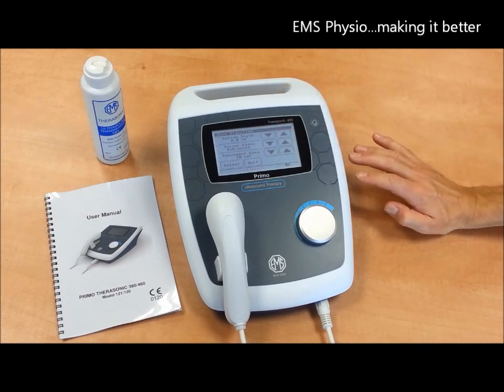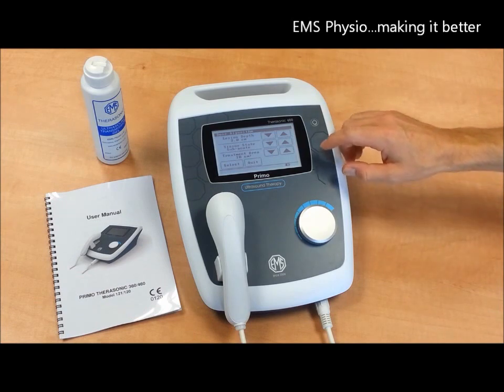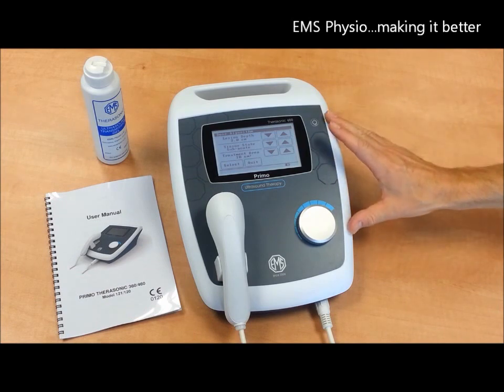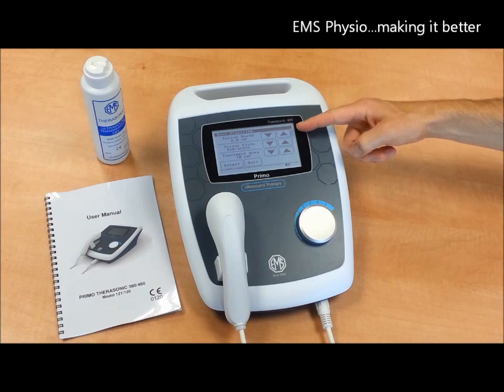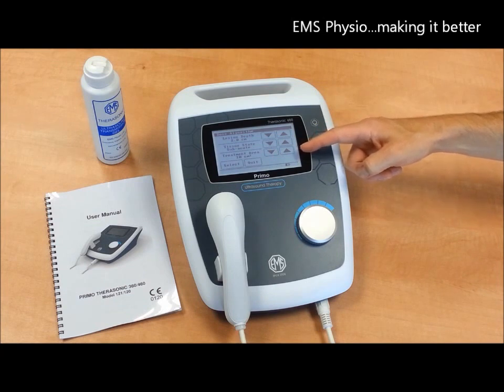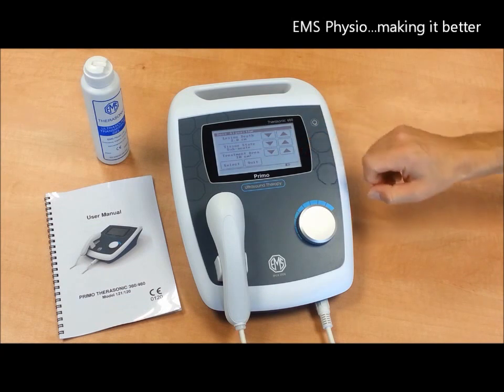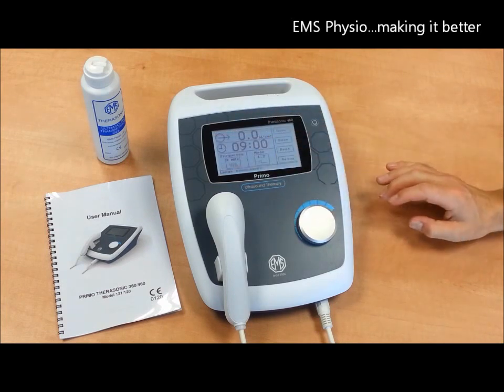Alternatively, you can apply the dose algorithm, which is uniquely available only on EMS Physio equipment, where you input the parameters of the injury you are treating, such as the depth of the lesion, the state of the tissue whether it is acute or chronic, and the size of the treatment area. The machine will then set itself automatically based on those settings.